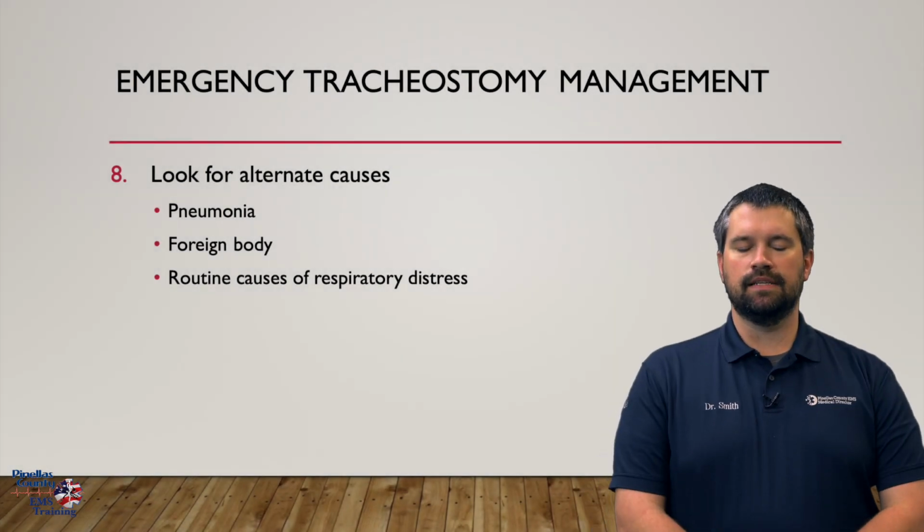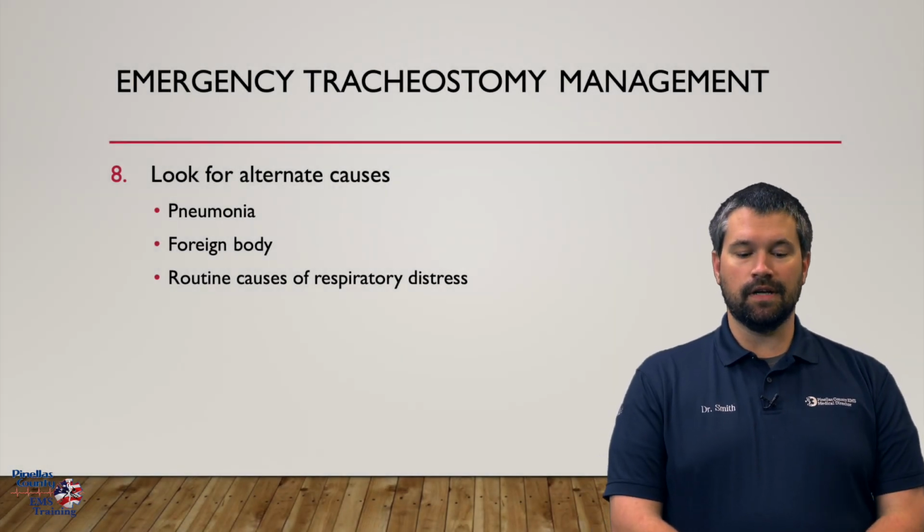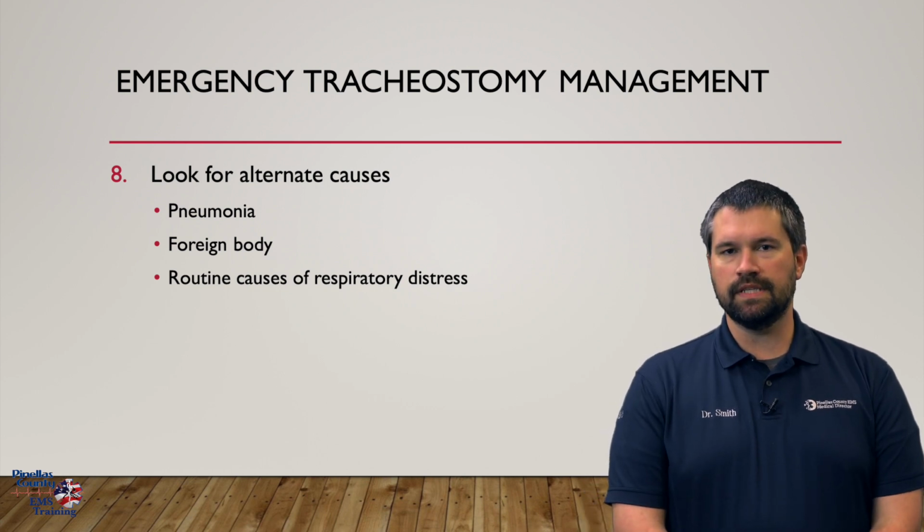And your last step in assessing the tracheostomy is looking for alternate causes. Pneumonias, foreign bodies are routine causes of respiratory distress that we see every day.